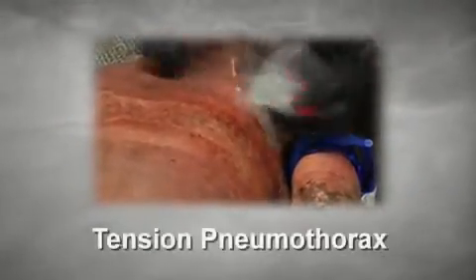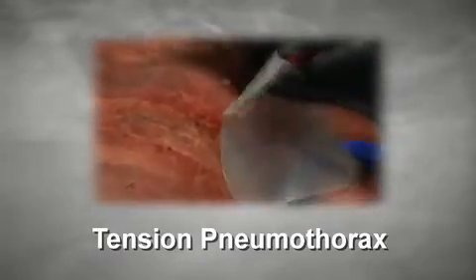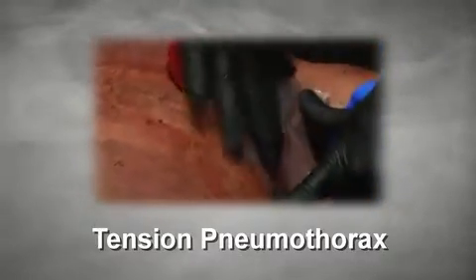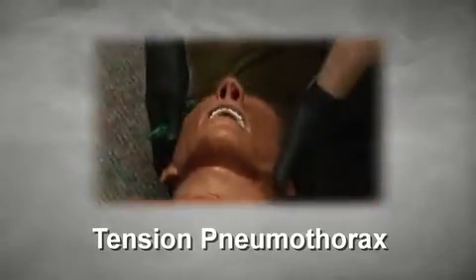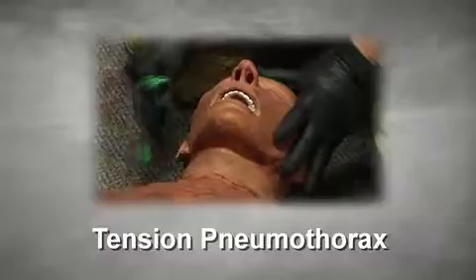However, if air leaks from the injured lung tissue and cannot escape, a tension pneumothorax can form. The vented chest seal is designed to allow air to escape, but it can become blocked with blood or other debris. For this reason, if the patient develops shortness of breath, altered mental status, or other signs of decompensation, a corner of the chest seal should be quickly lifted, then replaced to allow air to escape. Definitive management of this condition will require advanced life support assistance when tactically appropriate.